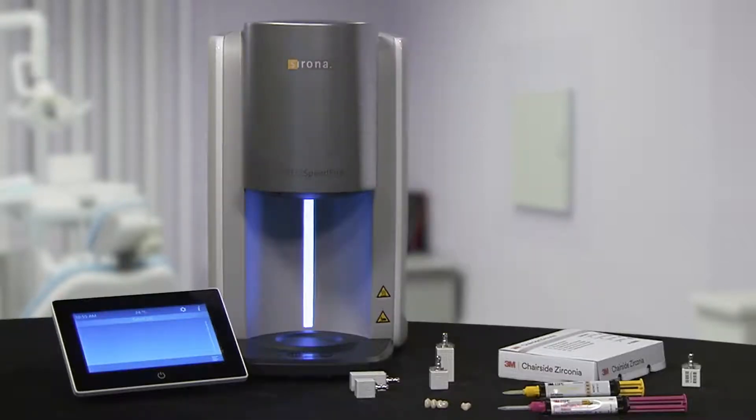Wet milling uses water, so it goes through a 10-minute drying cycle before the restoration is pushed up into the hood. People will ask why this oven can sinter so quickly compared to lab ovens — it's because of how small the oven is. It's similar to a convection oven where you can fit a maximum of about three restorations. With such a small area where the heat is going, we're able to sinter a lot quicker than what can be done in the bigger lab-based units.